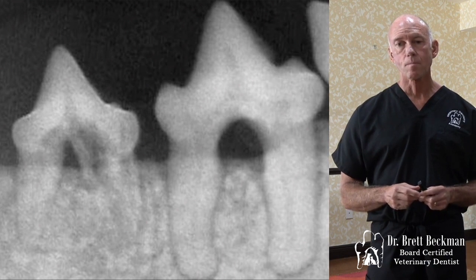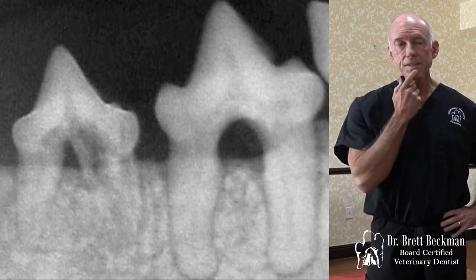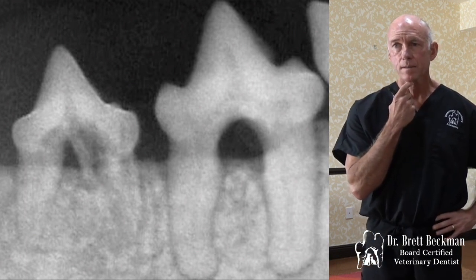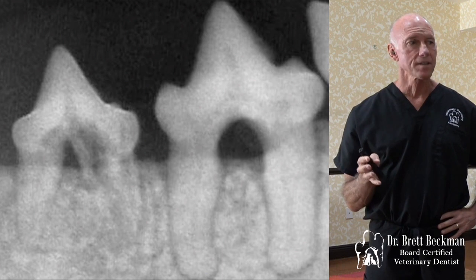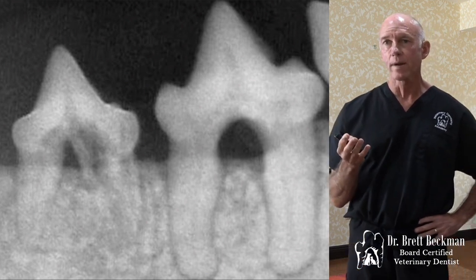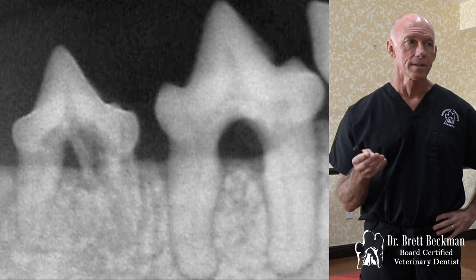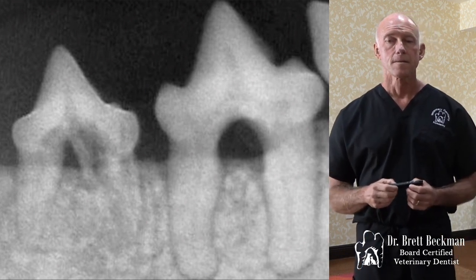On the tooth adjacent to it, on the 07, you've got the mesial root that's got a periodontal ligament space around it. It's pretty well defined. That is considered a type 1 because you can see that periodontal ligament space all the way around it, and consequently that, as part of your treatment for that tooth, needs to come out in total. So that needs to be a full extraction.